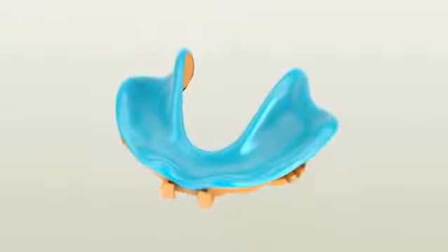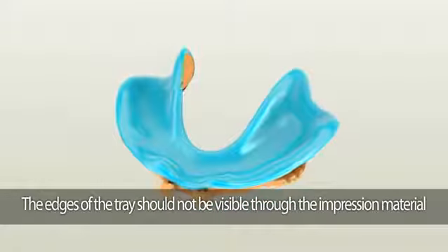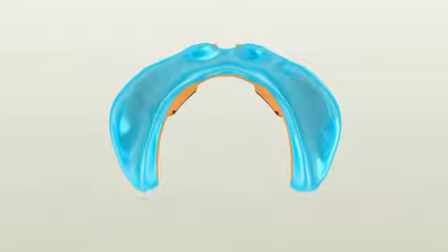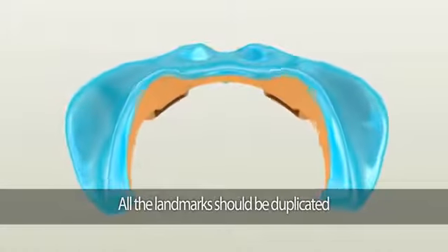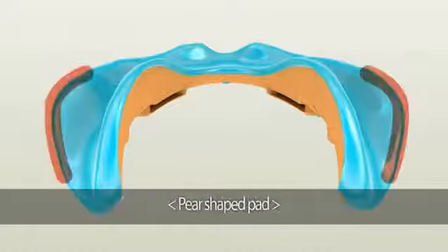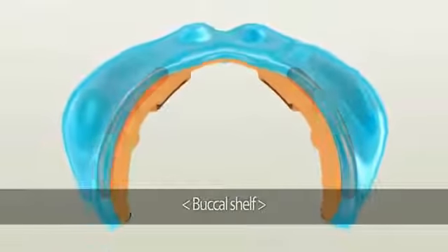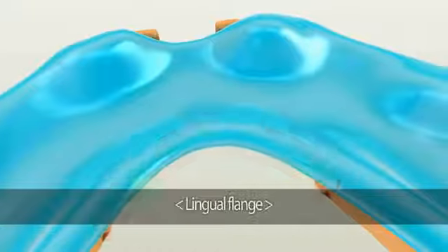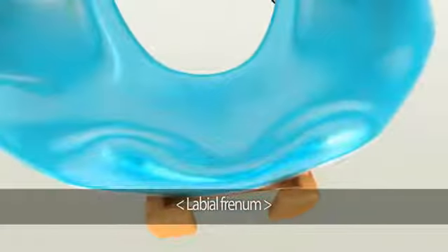There are two areas to check. First, the edges of the Dent Cut tray should not be visible through the impression material. If you see any plastic edges through the material, it means the tray is touching the soft tissue. If it does, simply remove it by using a slow-speed handpiece before taking the wash impression.